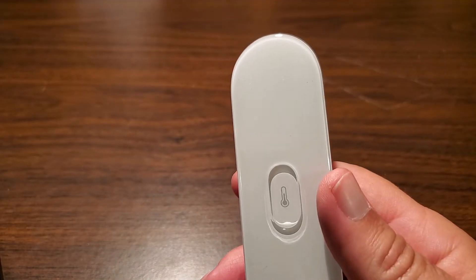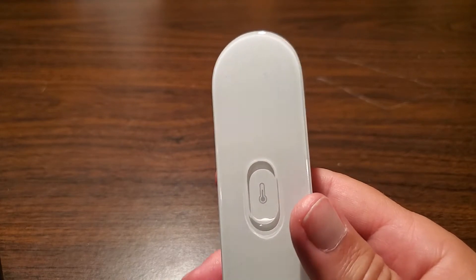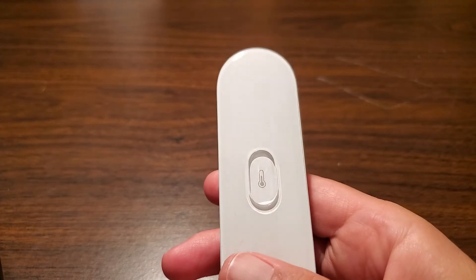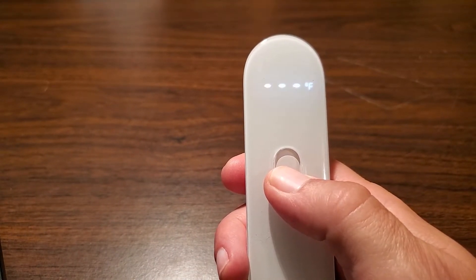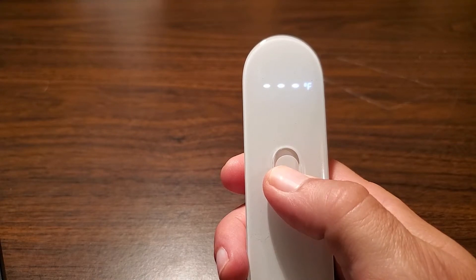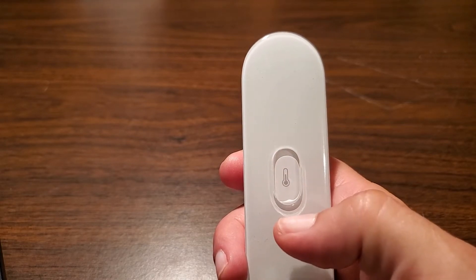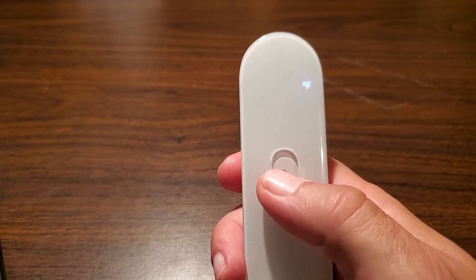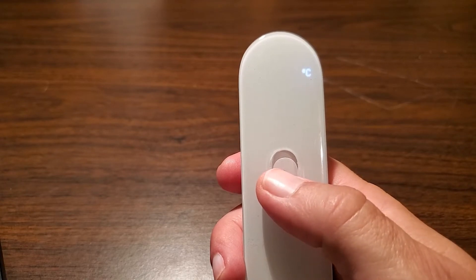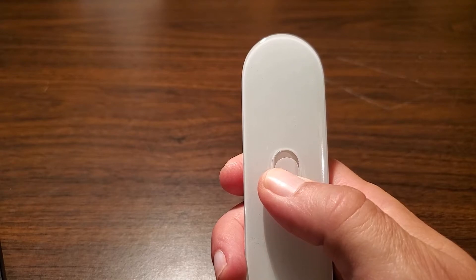My thermometer shipped in Fahrenheit, but if you want to change your unit of measure to Celsius, it's easy to do. All you need to do is pick up the device, make sure it's off, and hold the measurement button down while out of range of anything to measure. It'll change to a flashing C and F at the top — it takes about eight seconds. Now you just toggle the one you want. To lock it in, hold the measure button for another eight seconds and it'll automatically turn off.